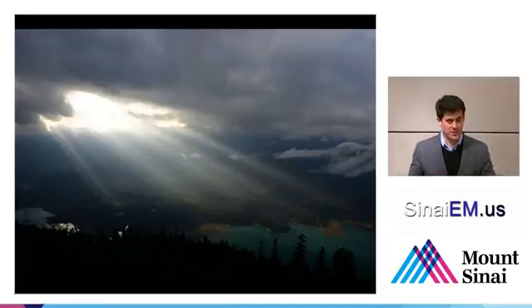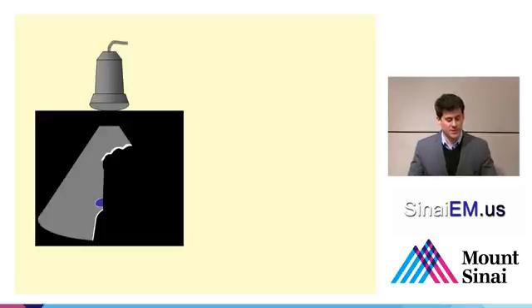So here's an example to illustrate the point. You can see here that we're putting the probe down into the patient from the anterior abdomen. On the left side of your screen here, you can sort of see the inferior vena cava and a bit of the vertebral body and its shadow behind it. But the right side is obscured by bowel gas. And what that's going to look like is a bright echogenic line that's going to typically be somewhat irregular and then shadowing all the way down behind it.